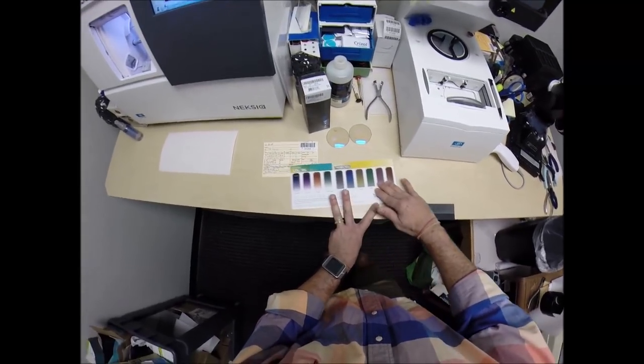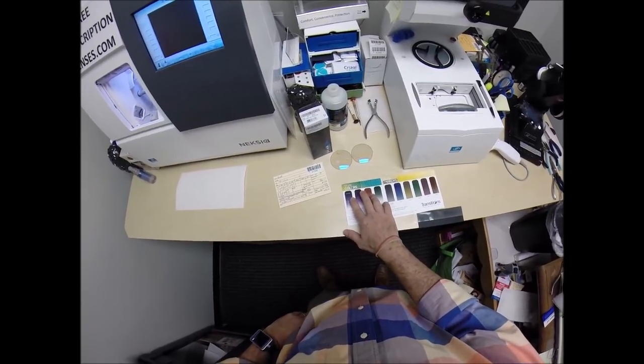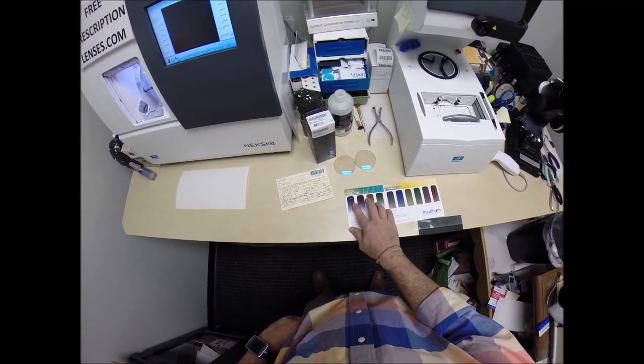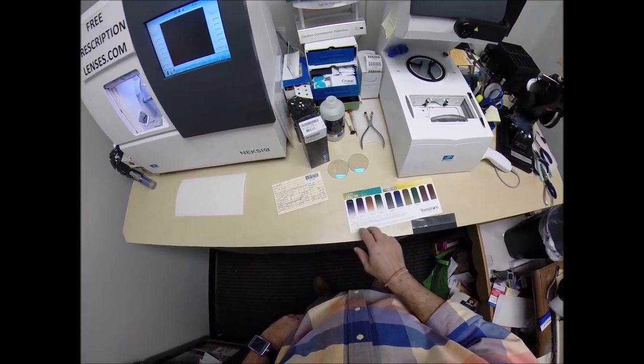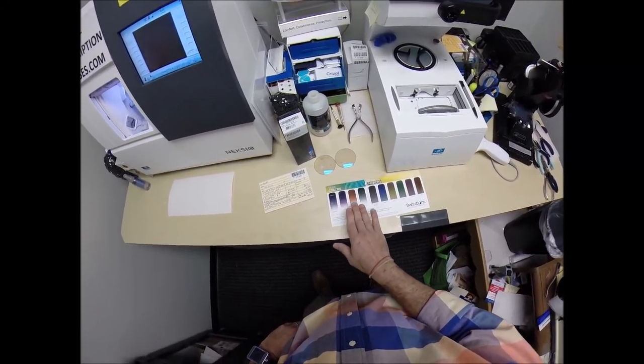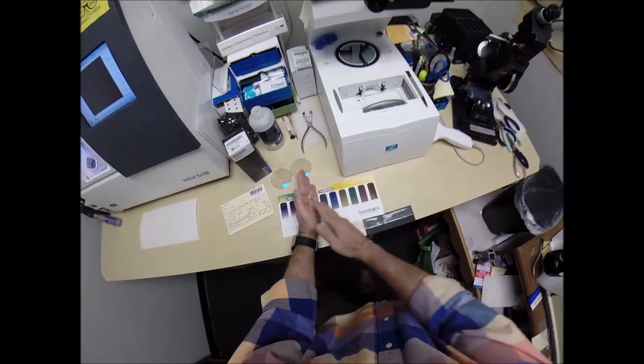That's in the Extra Active. There are new colors of style colors for the regular Transition Signature 7. You can get gray, brown, and green. But now you can do a sapphire, an amethyst, an amber, and emerald. But today, we're going to focus on these.